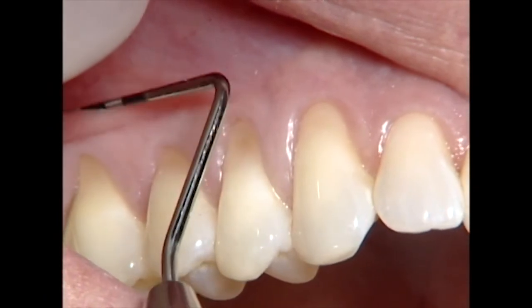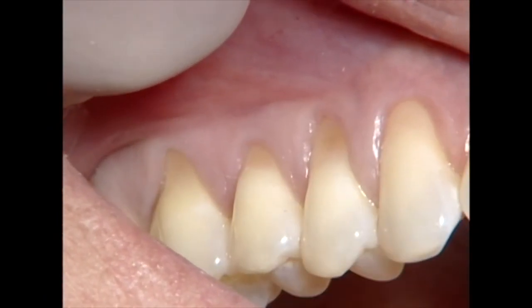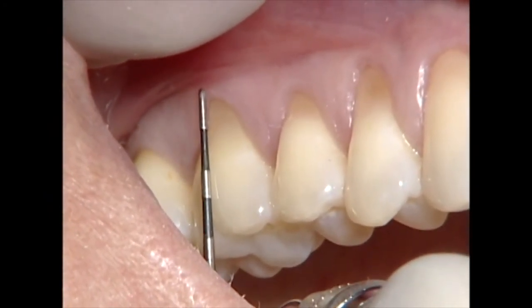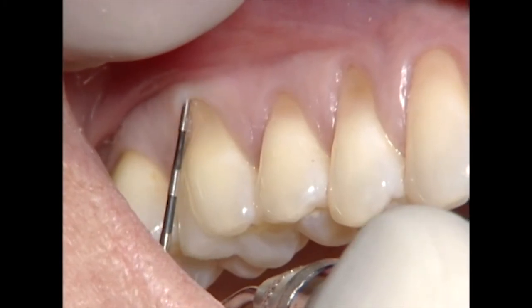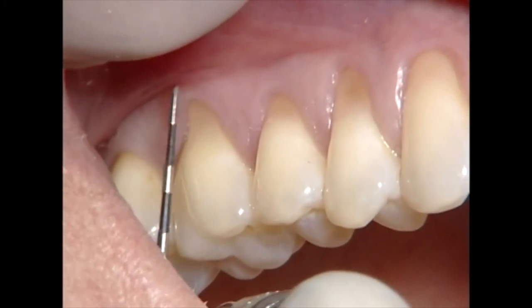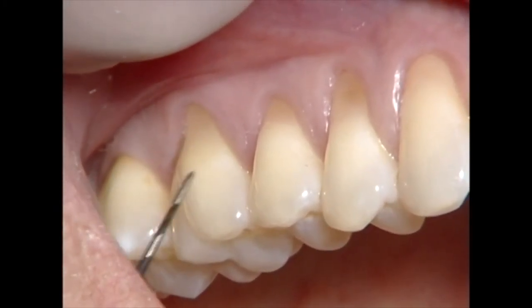As we go on to the molar area, the mucogingival junction is rather shallow. So there's a very small band of gingiva vertically — maybe a millimeter. And if we probe, none of that's attached. So this is all an area that's at risk of further recession, and we're close to the furcation in that region.